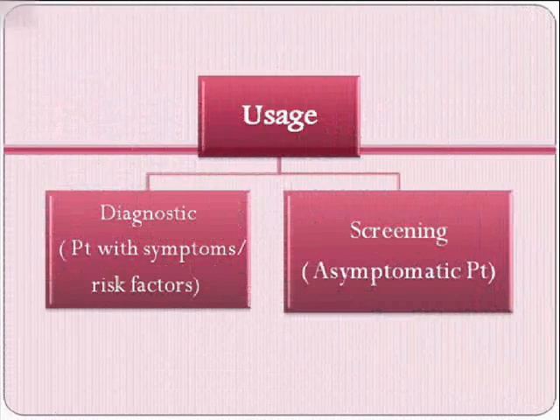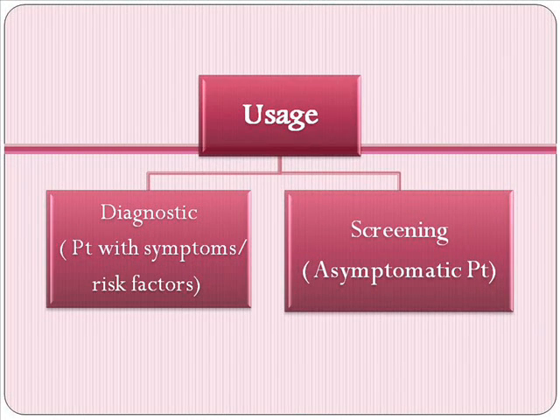As for the use of mammography, it is used for diagnostic or screening. Diagnostic is for the patient who has symptoms and a risk factor. And screening is for the patient who does not have any symptoms and does not have any risk factors, etc.